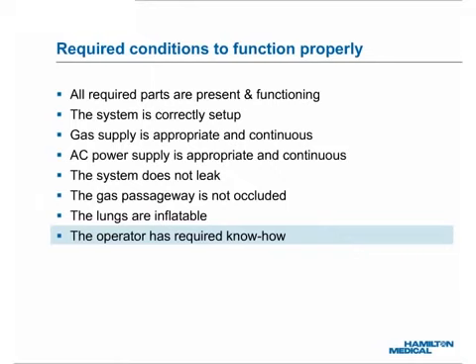In ventilator design and development, engineers assume that all of these required conditions are satisfied. In the real world, however, this assumption may not always be correct. This discrepancy could be the most important and most common root cause of the troubles and problems we sometimes experience during mechanical ventilation.